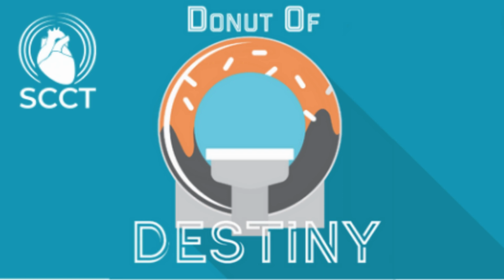They say that at more than 80 beats per minute, diastolic doesn't work, and systole works in most of the cases, but at very slow heart rates, it can be challenging because we want to go from the systole and extend the scan into the isovolumetric relaxation. And if the heart rate becomes very slow and you are just in the systole, your RCA will have some motion in its mid segment.